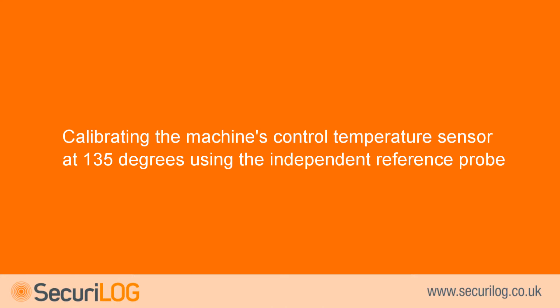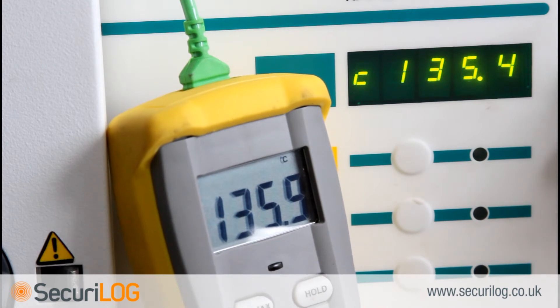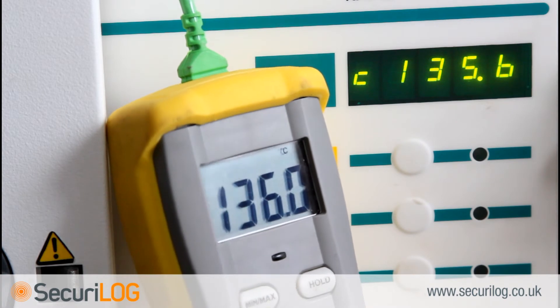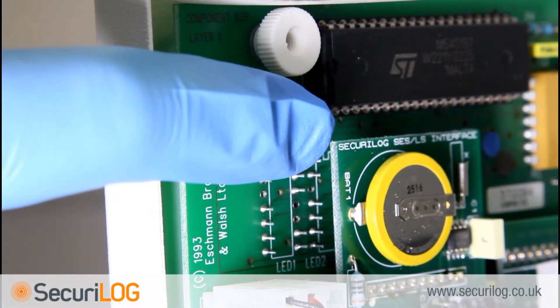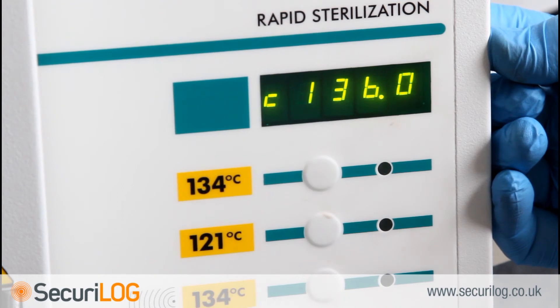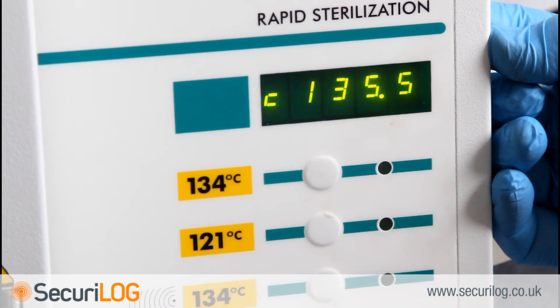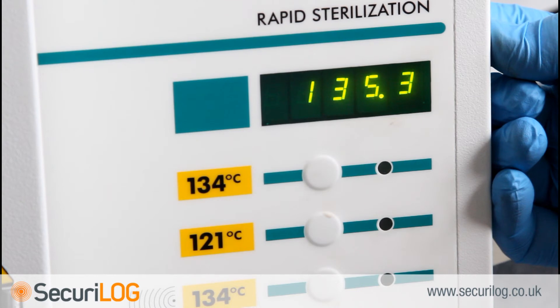Calibrating the machine's control temperature sensor at 134°C with the independent reference probe: the machine will now increase to 135.5°C in order to calibrate the 134°C cycle. There is a time limit of 3 minutes to calibrate the 134°C cycle. Check the steriliser control probe against the independent reference probe by pressing button 5 — the display will show 'C' indicating the control probe value. Continue to hold button 5 and use the trimming tool to calibrate POT R14 on the main board until the control probe value indicates the measured value from the independent reference probe. The Securilog probe can now be calibrated at 134°C using the now-calibrated control probe value. Switch between probe values by pressing button 5, and use the trimming tool to calibrate POT R6 so that the Securilog probe reads the same as the control probe.